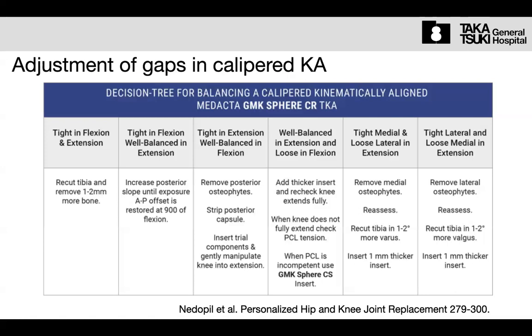Okay, so another solution is a little bit of soft tissue management. For example, remove posterior osteophyte and do a posterior capsular release.